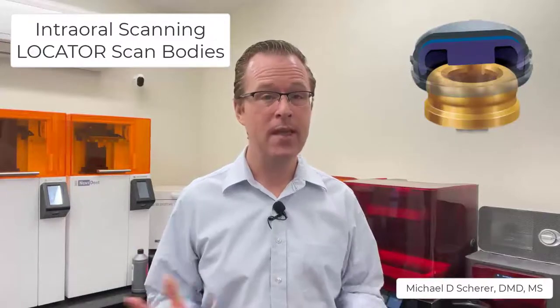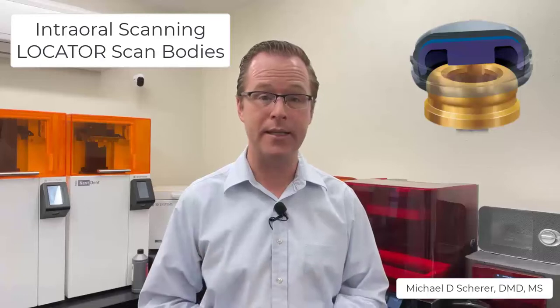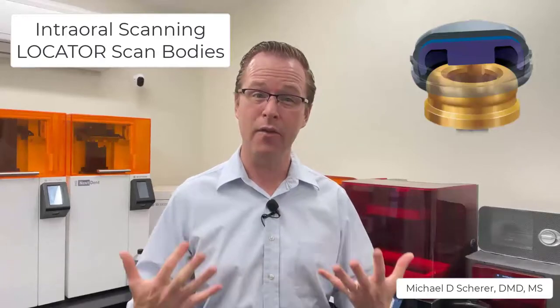Hey everybody, this is Dr. Michael Shearer. In this video, we're going to be talking about how we use our locator scan bodies to do an intraoral scan of an edentulous ridge with locator abutments in place.